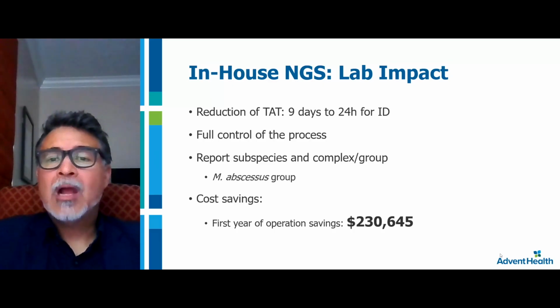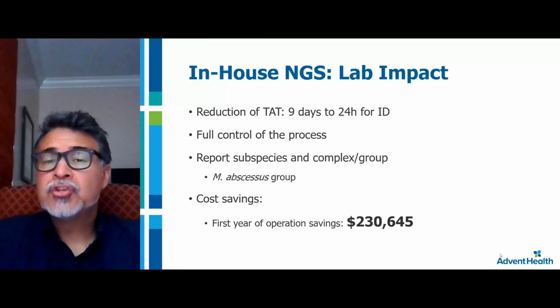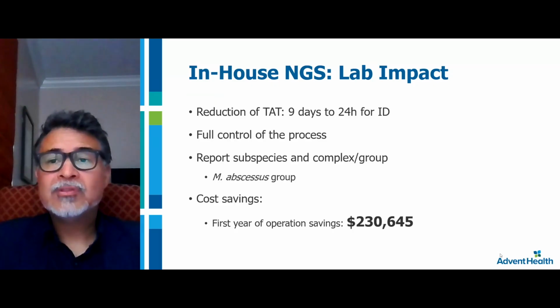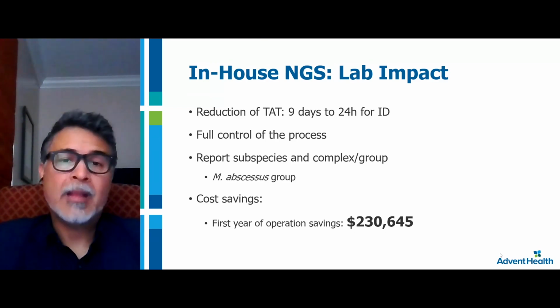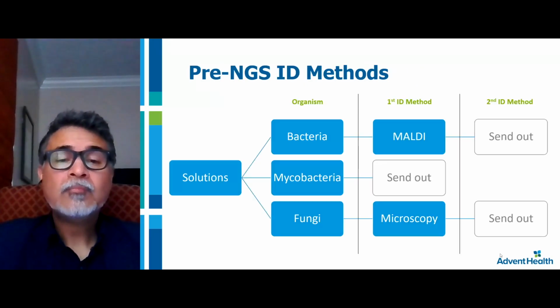So the question is, how can we justify the use of NGS, right? Sometimes we don't have in the US a CPT code to be able to charge or to bill for these tests. Well, as an operational cost, if your laboratory use reference laboratories, this is an important step to reduce the impact of the cost as an operation of your laboratory. So I think this is a significant improvement of operation and also give us the capacity, the capability for having this technology in-house.